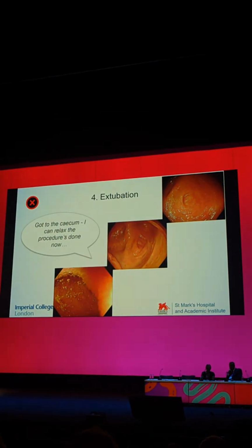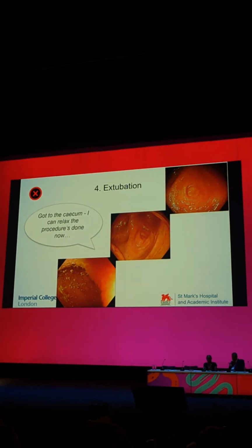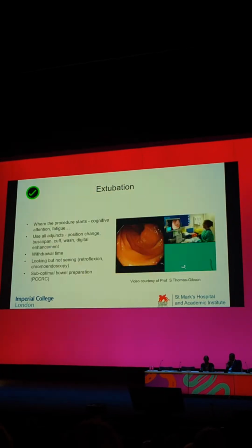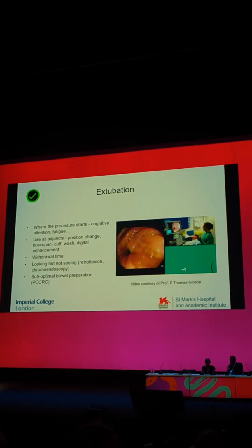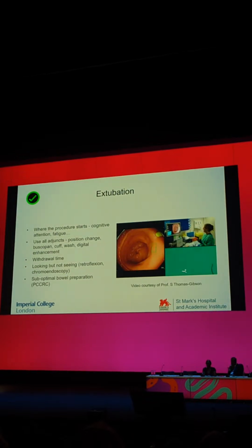So the fourth mistake relates to extubation. So we all love these images, beautiful cecal landmarks. You can relax with the cecum now, we're over, we're done, we're home. This is incorrect. This is where the procedure actually starts. But we have to be mindful of the fact that this is the point where cognitive attention may be diminished, and the endoscopist and the team and the patient might be quite fatigued and fed up, particularly if you've had a difficult intubation.